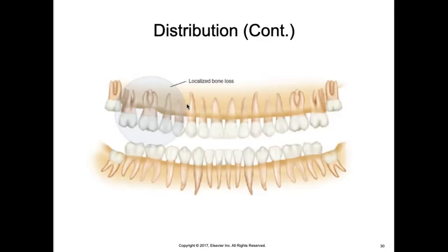There could be several reasons for this. There could be an ill-fitting crown in this area. There could be things that this patient keeps getting stuck here. There can be open contacts, which create a food trap. Anytime you have a food trap in the teeth, that creates areas for bacteria to accumulate and fester in the area, which will cause the bone levels to drop here.